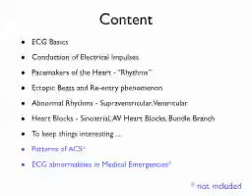This is a series of lectures meant for the arrhythmia recognition part of the ALS course. This being part 1, we will look at the basics of the ECG. The other parts will deal with the conductions, the rhythms, and subsequently the abnormalities of the ECG that are common and need to be recognized for the ALS course.